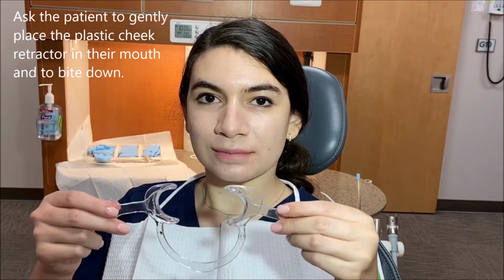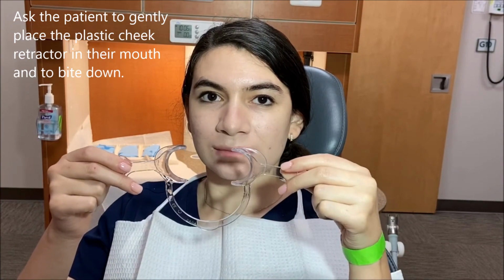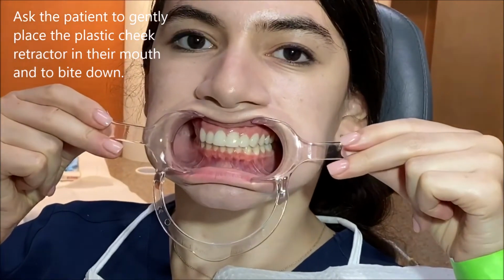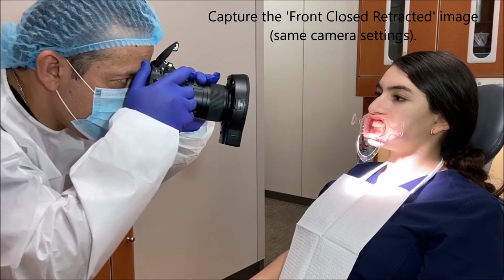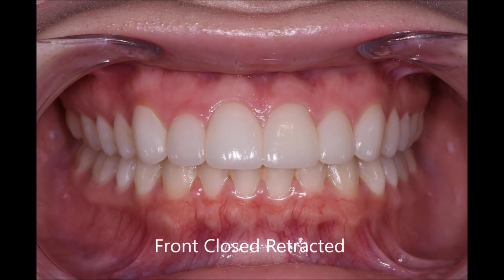Ask the patient to gently place the plastic cheek retractors in their mouth and to bite down. Capture the front closed retracted image, same camera settings. Front closed retracted.